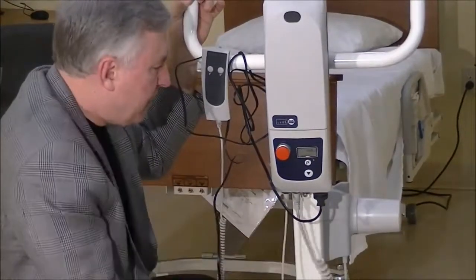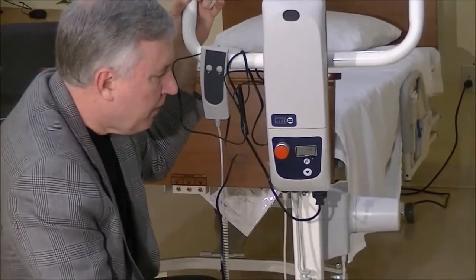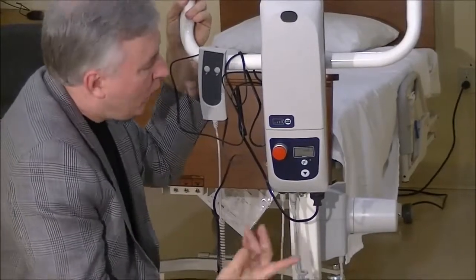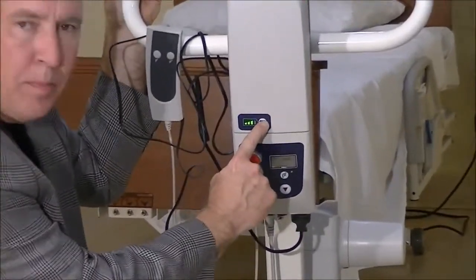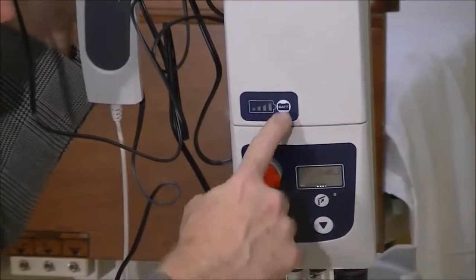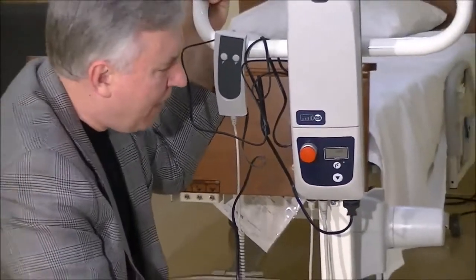Let's say we've got that checked and it looks okay — we know we've got it unplugged and the lift still isn't working. The third thing to check is that the battery has power. Simply push the battery symbol on the battery itself and it will light up. If the battery is lighting up, we know it has some power.